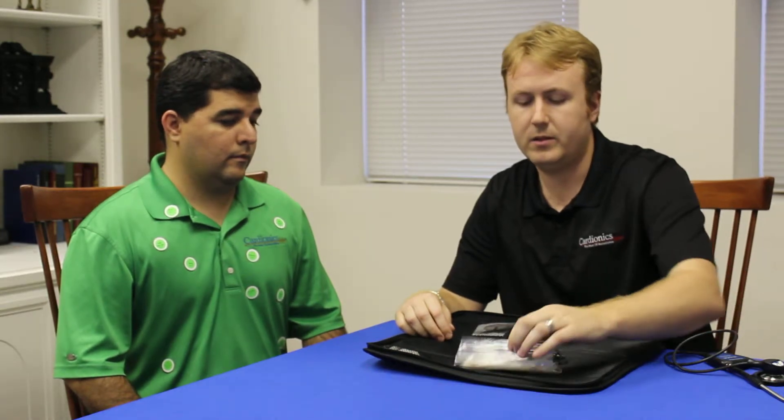Many institutions will purchase additional SimScope packages, which do not come with the software. The software is sold as a site license and additional scopes are sold at a reduced price. We have many institutions purchasing 5 to 10 and requesting quotes for up to 30 SimScopes. We're seeing a very good reaction to the product — institutions want to fill all their clinical exam rooms with the stethoscope, which is why we're getting such high volumes of requests and orders.